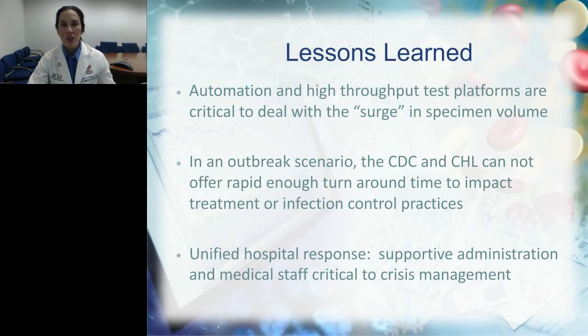So we also learned that automation is critical. These high throughput platforms really can save us in these types of outbreak situations. And then also, and this is an important lesson, and it's not a negative about the CDC and our public health infrastructure at all, but we did learn that the CDC and our state labs cannot give us results in time to impact patient care or infection control practices.